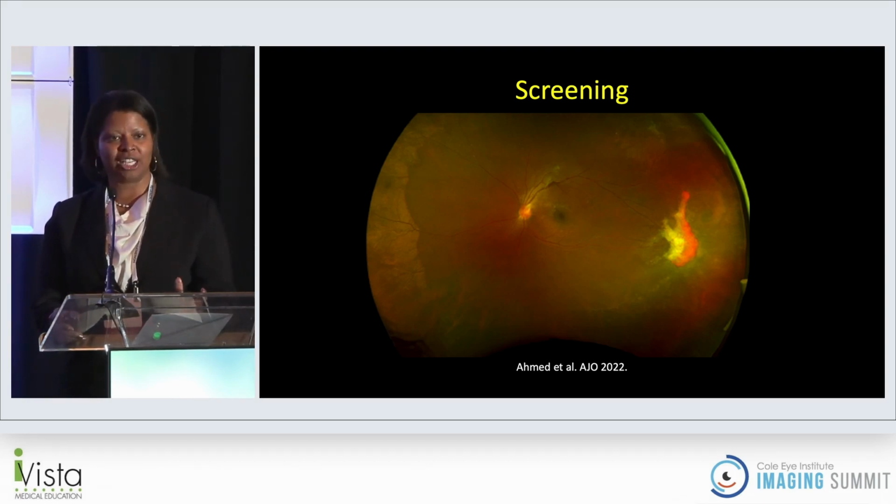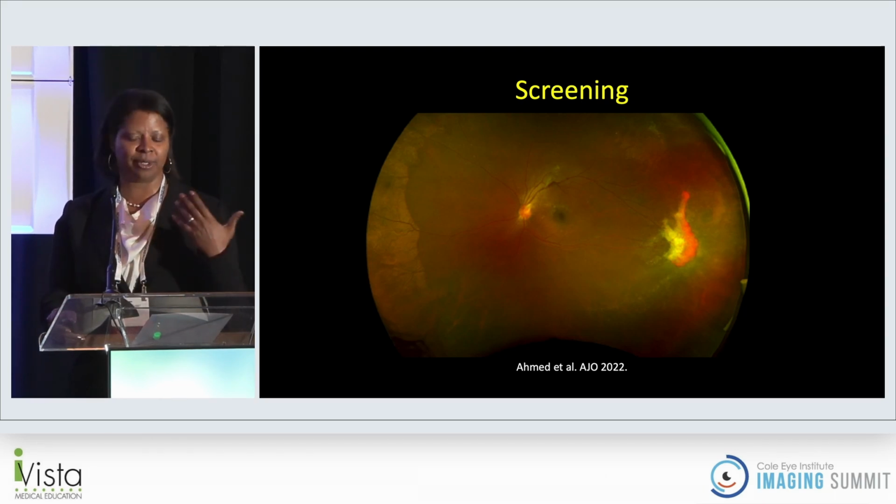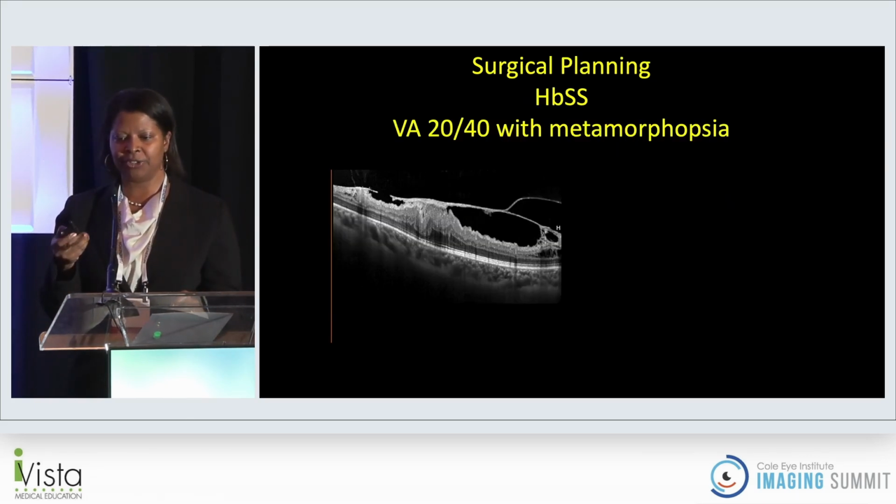And the manager of the hematology clinic was aided by one of our research coordinators and a student, and they were able to take these beautiful photos. And this was kind of the poster child. We were able to find referable sickle cell retinopathy and able to see that patient in clinic to confirm the findings. But this is through a non-mydriatic, non-professionally trained photographer obtained image.